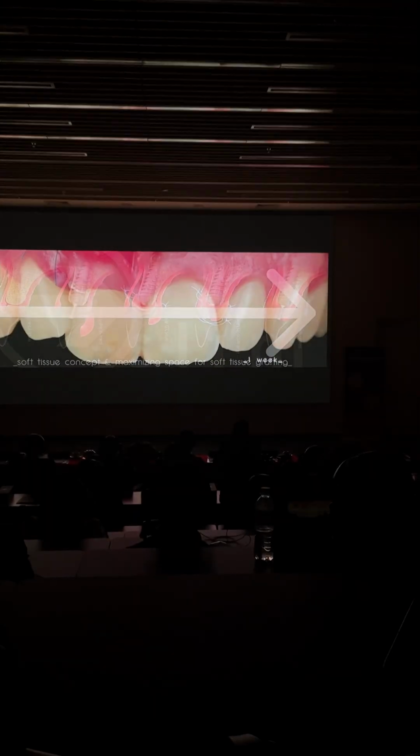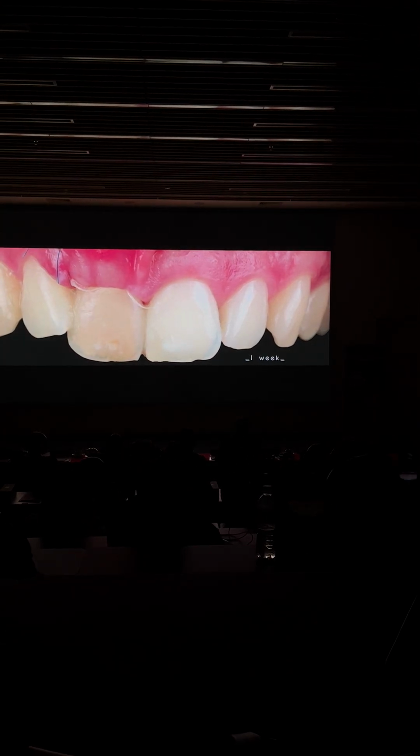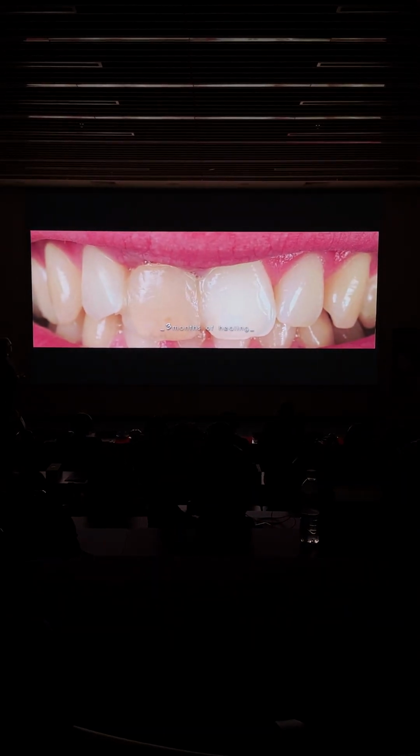So I have already discussed where we place the incision. This is how it looks like 1 week after. And the less titanium, the more space you have to increase your soft tissue. So this is about 3 months.